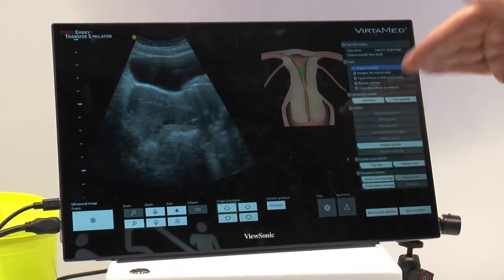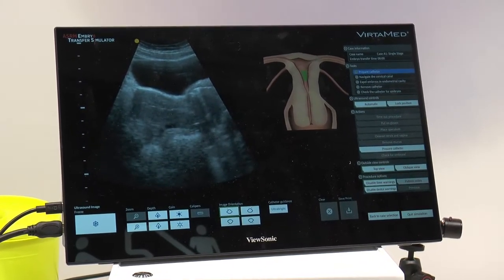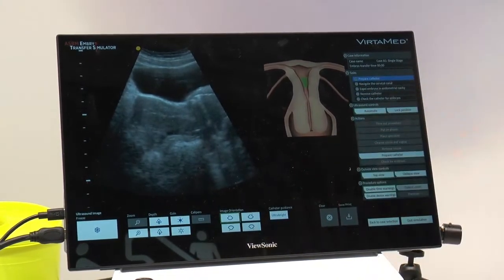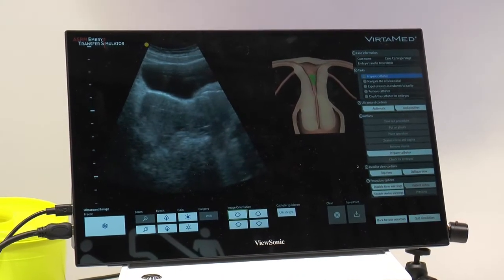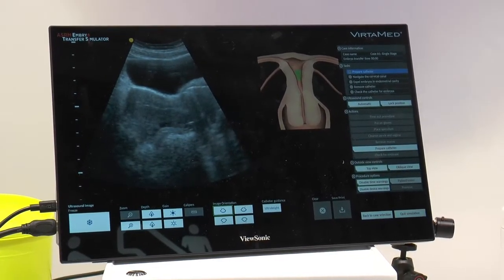And you can either have them on so the person has to follow them manually, or for the case of demonstration to you, I've just switched them off. But I have to follow them, otherwise the system won't record my endeavors. So, thank you. So we've got the catheter in place.